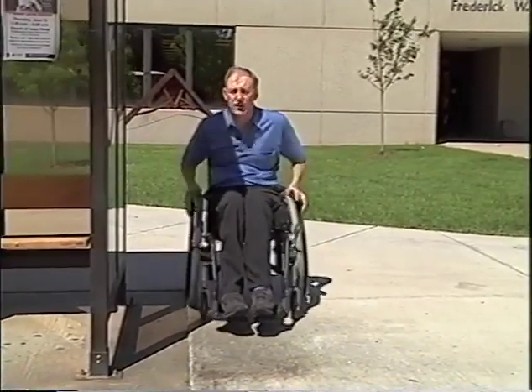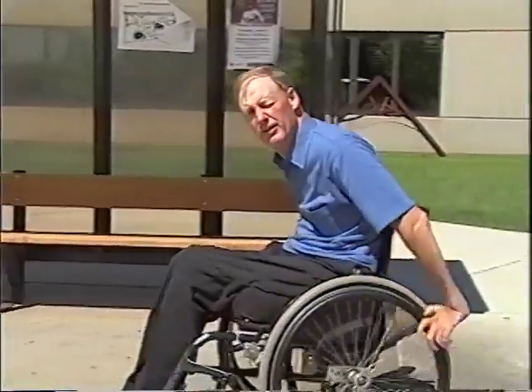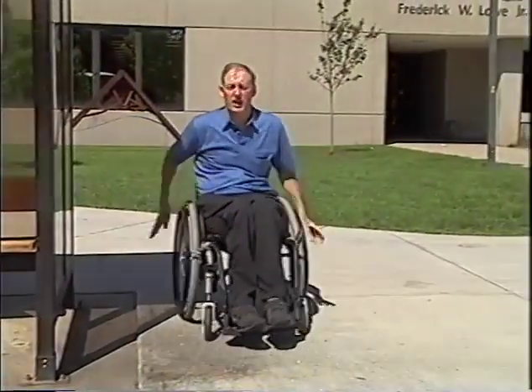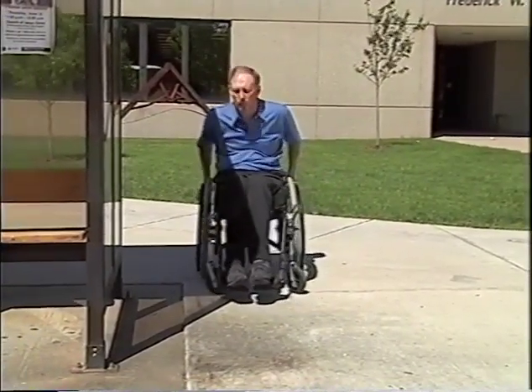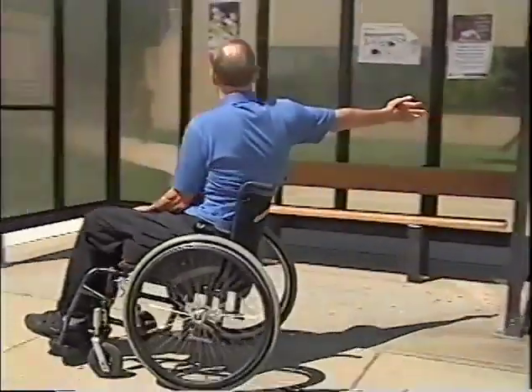If you don't have your thumb up and you have your thumb down, you're going to be in the wrong position to push off. So what we want you to do is be able to put all of these elements together as you teach or learn this skill. Wheel along, come around the corner, get in close, and push off.